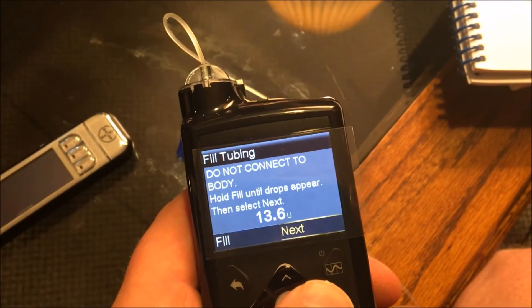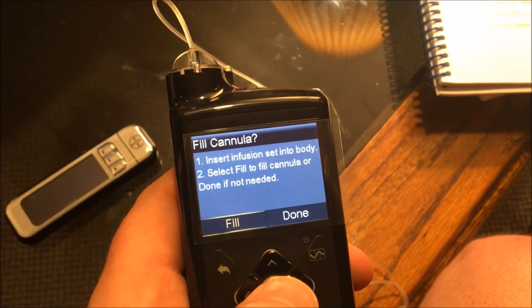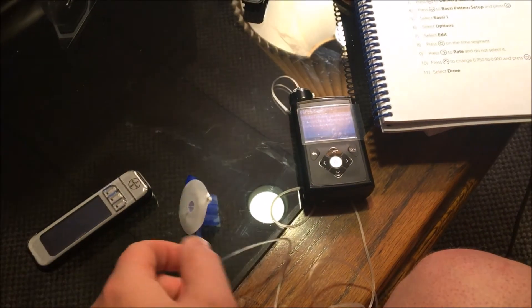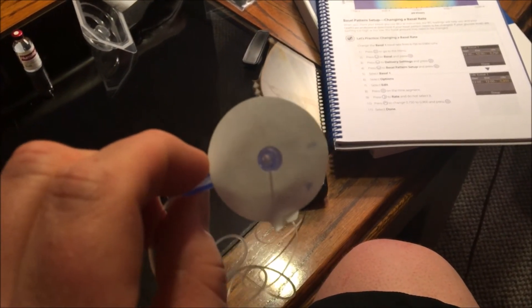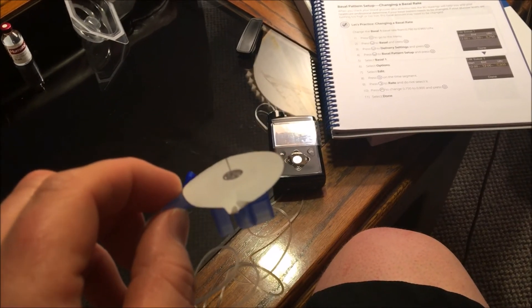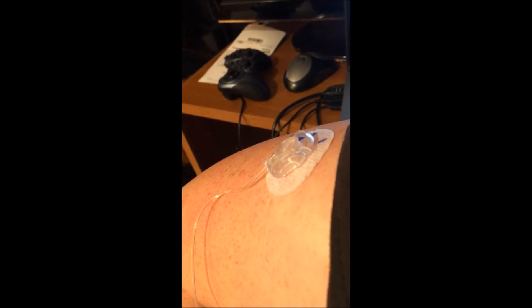Next: insert infusion set into the body. It's going to be a little challenging on camera. I'm just going to connect to my body — I do not use the insertion device for that. I actually peel off the sticker and stick it on my arm. I'll do that real quick and I'll be right back. All right, there it is.